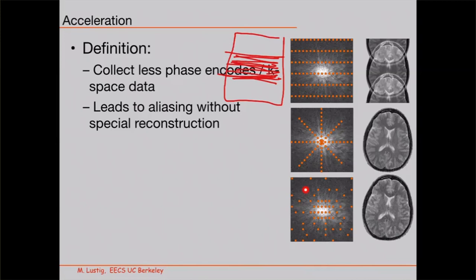These represent basically phase-encodes, 2 dimensions out of 3D. So that is feasible. Otherwise, you would have to jump around something like this, and that would be a nightmare to implement, as well as for the gradients. I mean, it's too long and it's really not going to be fast.